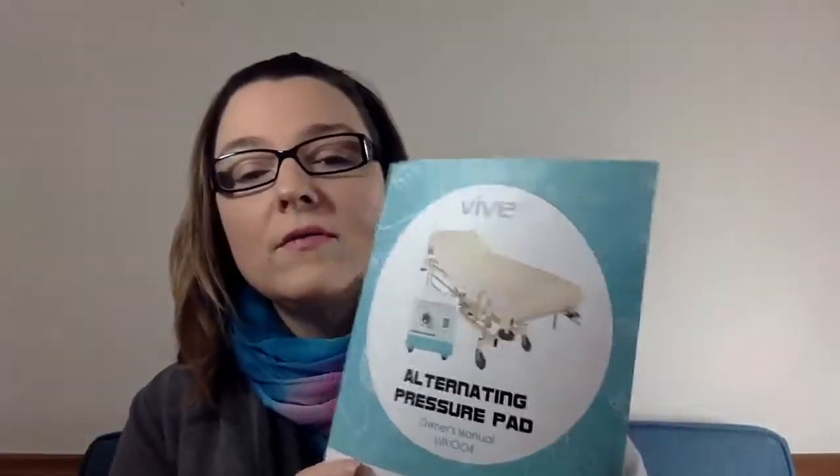The first product we got was this one right here — the alternating pressure pad. It came very well packaged and inside the package was one of these great little user guides.